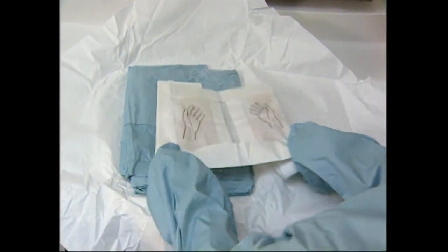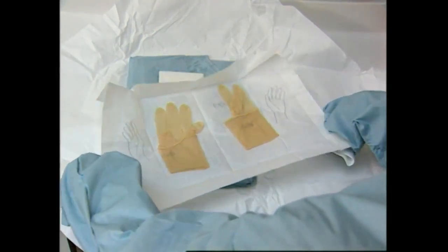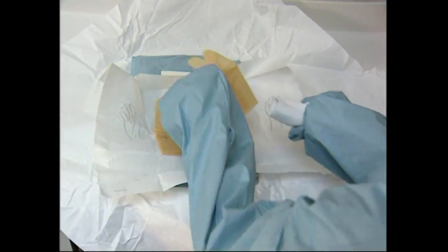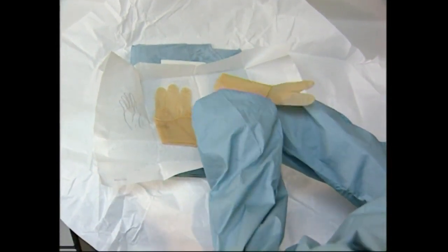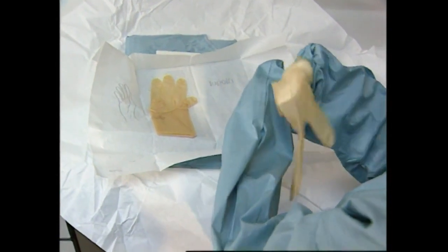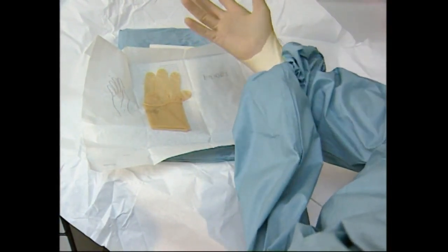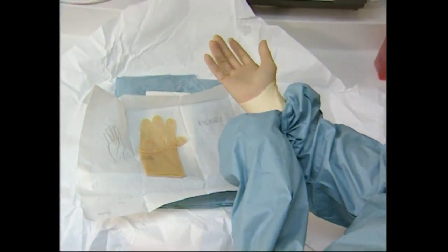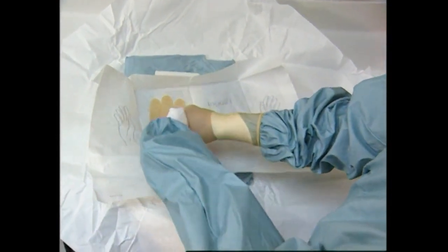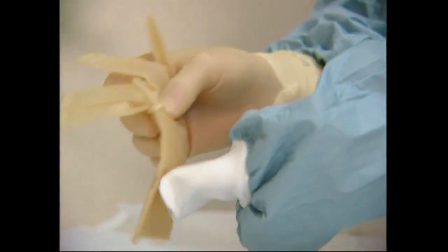The closed technique for gloving is considered to be the most suitable for preventing a breach in asepsis. The packet of gloves is picked up and opened using the sleeves of the gown. The glove for the right hand is picked up and placed on the sleeve with the fingers pointing towards the elbow and with the thumb of the glove adjacent to the thumb which is still inside the sleeve. The glove's cuff is gripped through the sleeve by the right hand. The other side of the cuff is gripped again through the sleeve and pulled over the end of the sleeve. The hand is then pushed through the cuff into the glove by pulling gently upon the sleeve. The glove for the left hand is now picked up and placed on the left sleeve with the fingers to the elbow and the thumb to thumb.